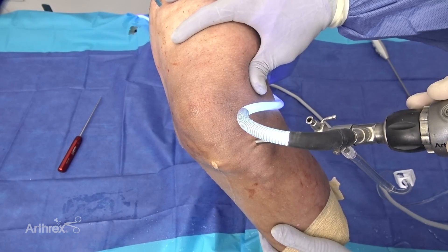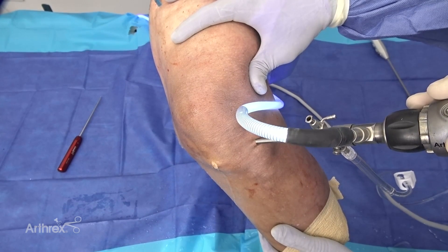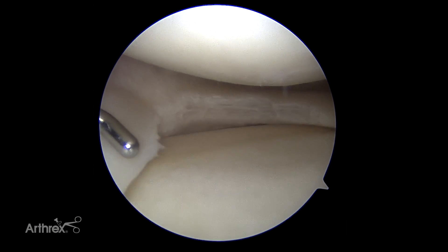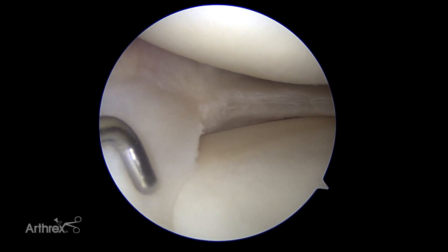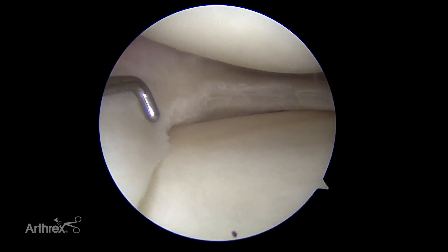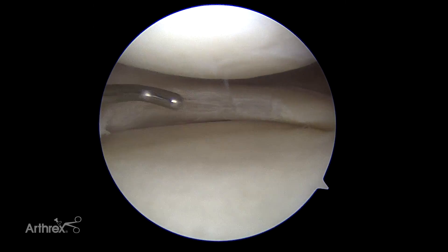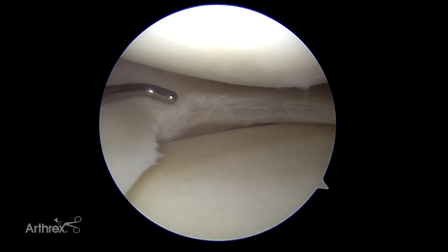This is a left knee and we're going to demonstrate a segmental meniscal transplant today. This patient had a partial medial meniscectomy — a pretty classic tear that's been trimmed to the posterior horn. Here's our root, and this was the transition point of removing the tear.